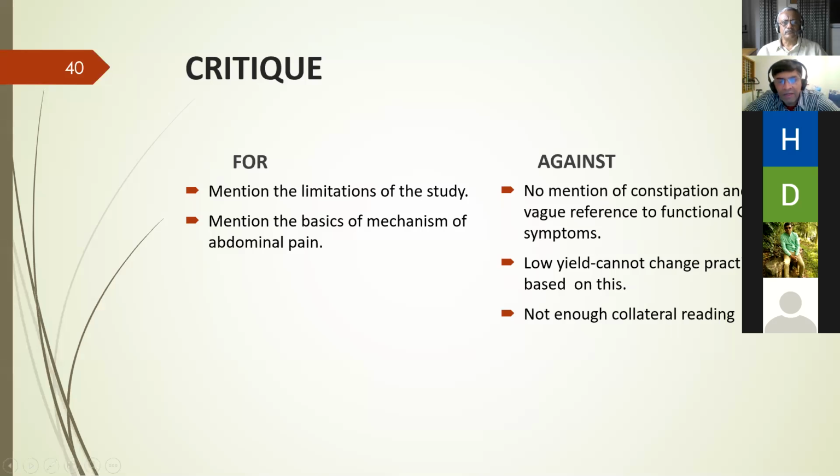I think the main point to be taken home is that in a country like India, as we know, PET CT is being misused as a diagnostic tool. This definitely should not be prescribed, because it will open a Pandora's box, not only in terms of usage of PET CT unnecessarily, but then follow-up of these PET CTs and going on a wild goose chase. So it should be very, very selective in terms of usage of PET CT as a diagnostic tool in chronic abdominal pain.